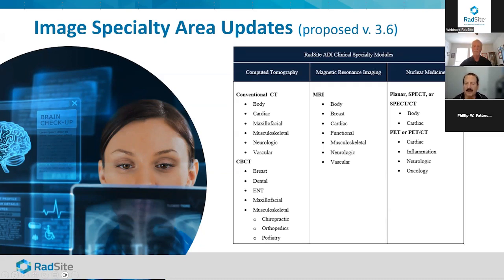So I'm sure Dr. Patton has some ideas also, but I really put a tremendous amount of stock myself in the testing and expertise of our physicists, rather than in just some of those parameters that are kind of touted maybe by some of the vendors. And so in my own opinion, I think that any of the payers that are specifying very specific parameters for number of slices or for field strength or for age of the equipment, for example, to me, I think if our physicists can empirically demonstrate performance, then I think that would guide me to a greater extent.